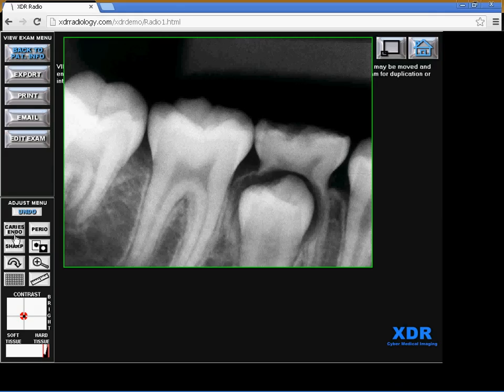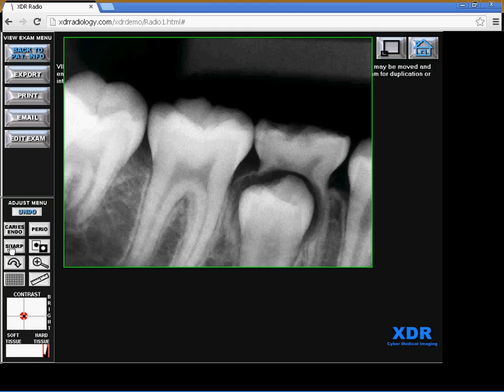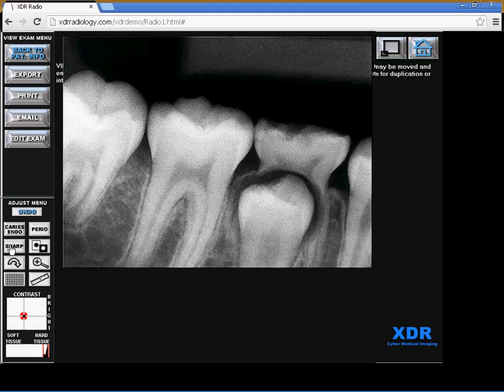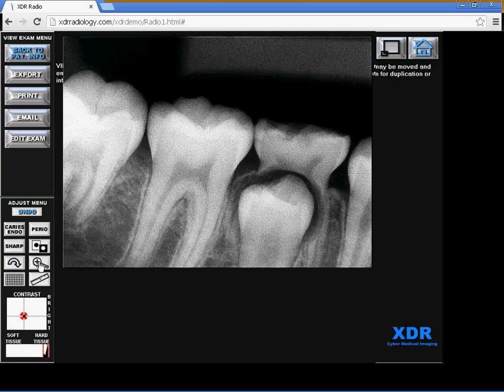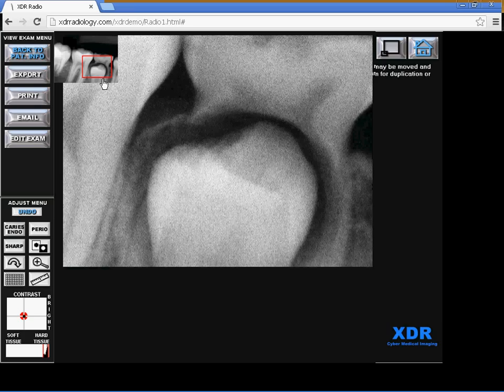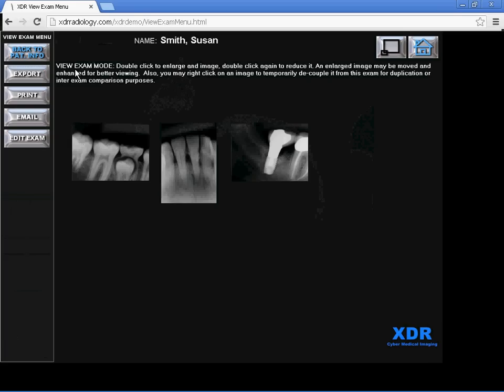The caries endo tool, the perio tool, the sharpen tool. Let's click on sharpen—it sharpens it—and then you click on zoom. You can zoom in on any particular area and various other tools.